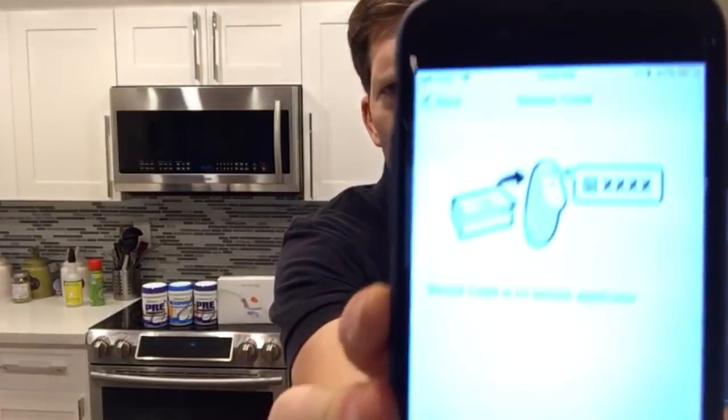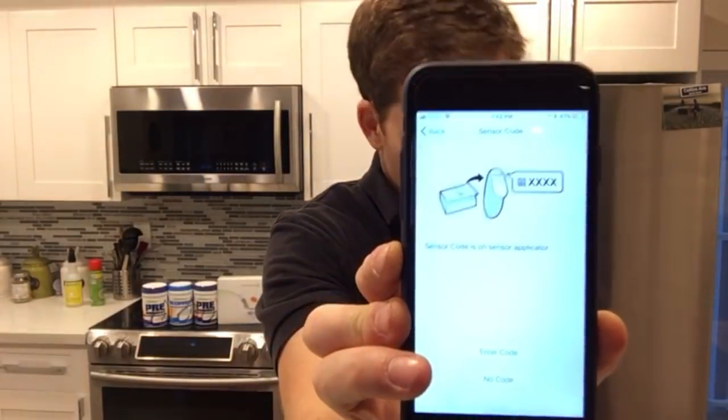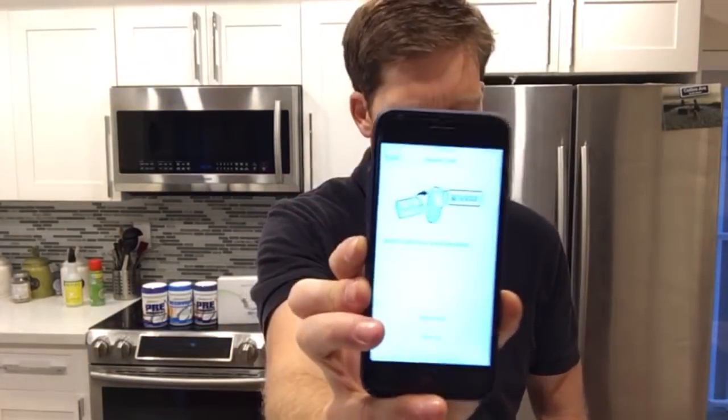You click through a few more 'I understand' screens, notifications on, et cetera. Then you get to this part that says the sensor code is on the applicator and you need to enter your sensor code. So this is when you grab your applicator — this is the new sensor with the applicator. You look right there: 5937. You can either take a photo or you can go through the hassle of entering four whole digits. I'm just gonna enter it here: 5937. Save. Confirm entry. Confirm. And we are good.